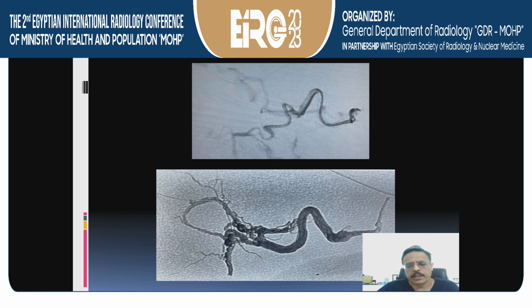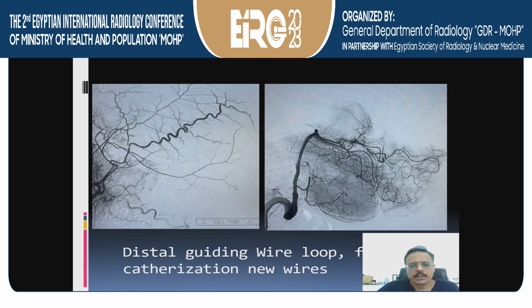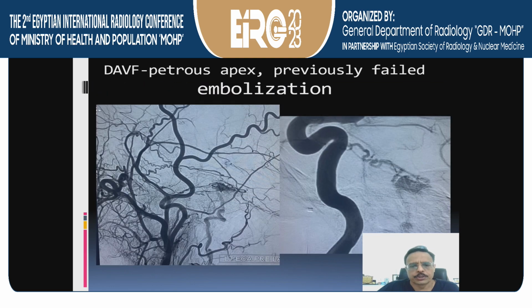Then you can penetrate, as one can see, the artery, the complete network, as well as the origin of the vein, and then this is a complete cure in this patient with a very high degree of safety. The final angiogram shows complete occlusion as well.